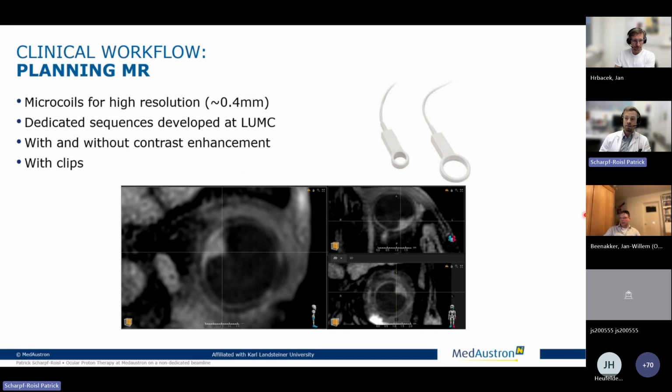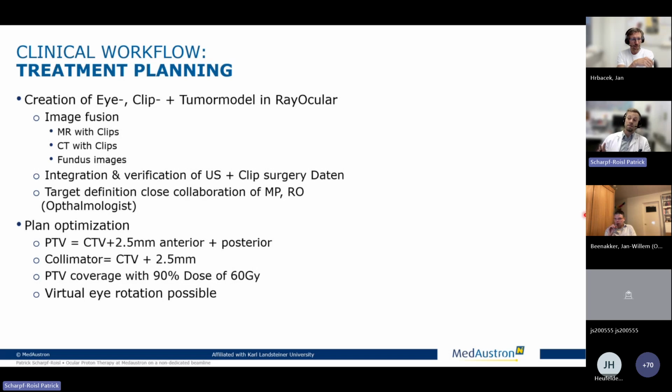We got some dedicated sequences developed at the LUMC and provided thankfully by Jan Willem, who's also present today, and we perform MR both with and without contrast enhancement, and importantly, we also now perform them with clips. I will come to why we do it with clips later in our treatment planning workflow, because what we intend to do is to create an eye clip and tumor model in the RayOcular module, which is positioned within RayStation and allows the creation of an eye model.